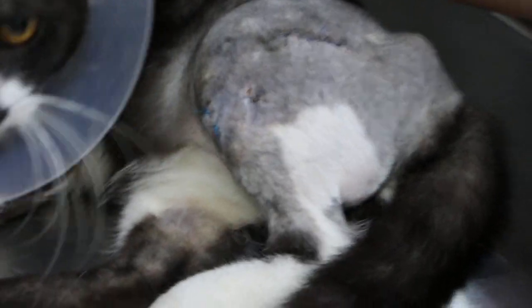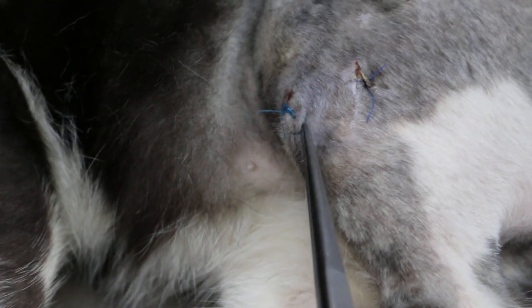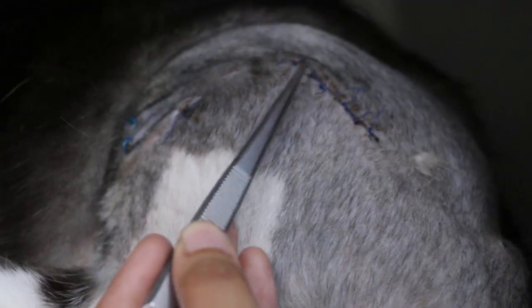Now you can see the wounds. The wounds are actually below — those two wounds are the skin wounds and are not part of the surgery. Then the main surgical wound is here, on the lateral part of the femur. That's about 4 cm.